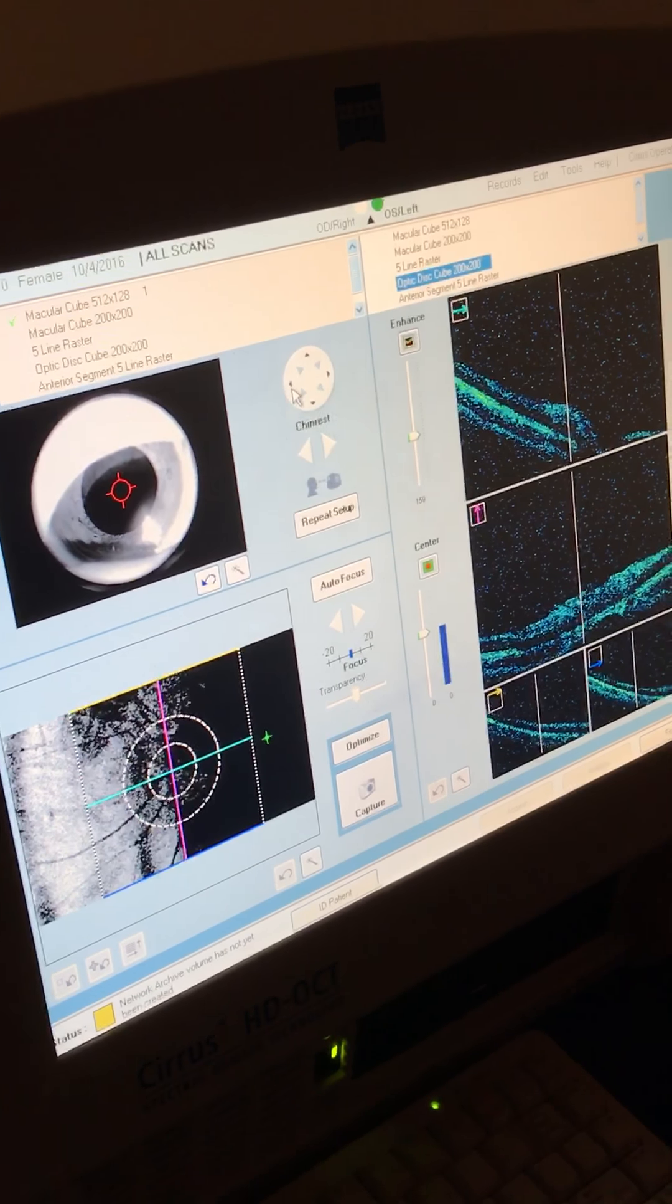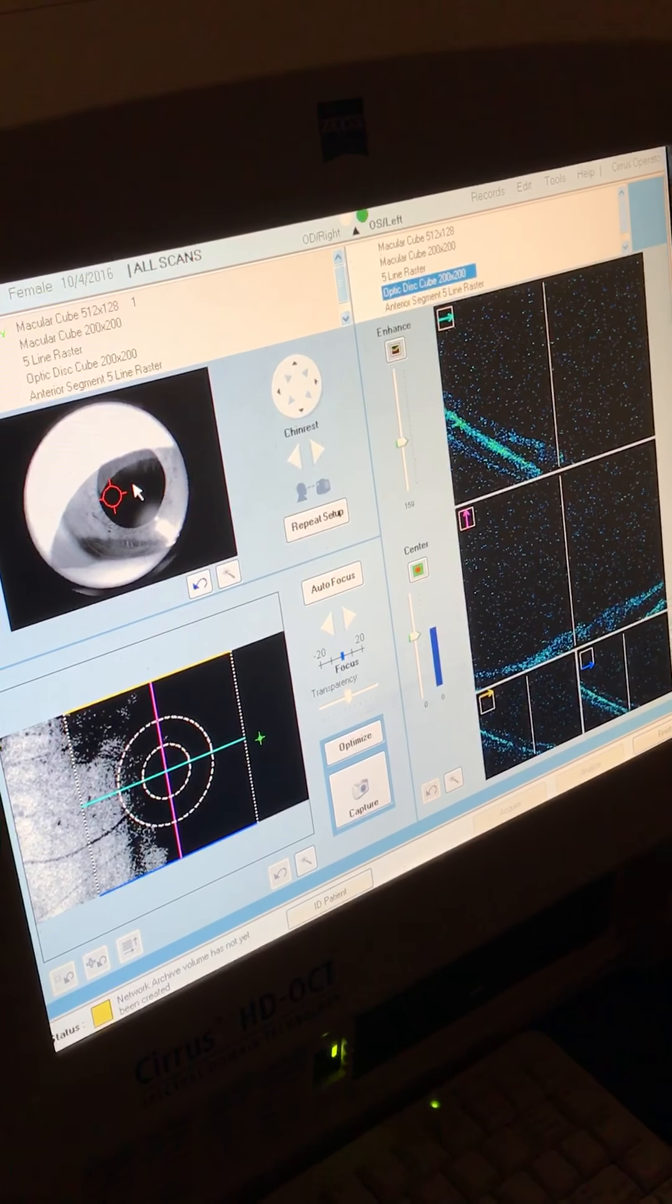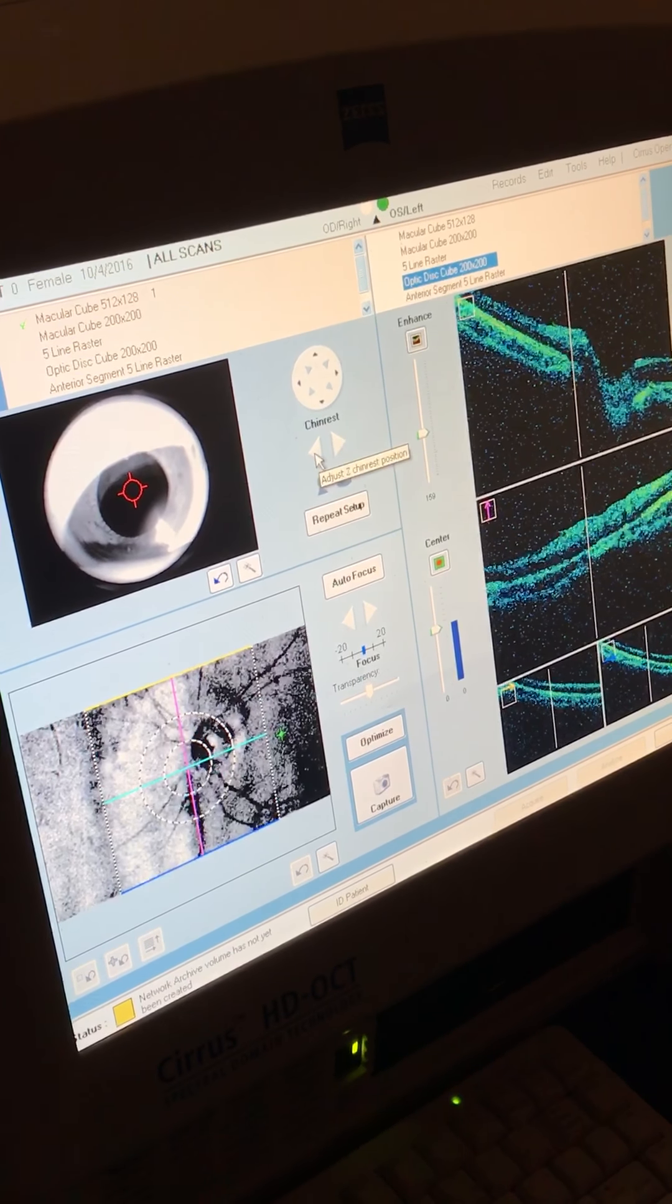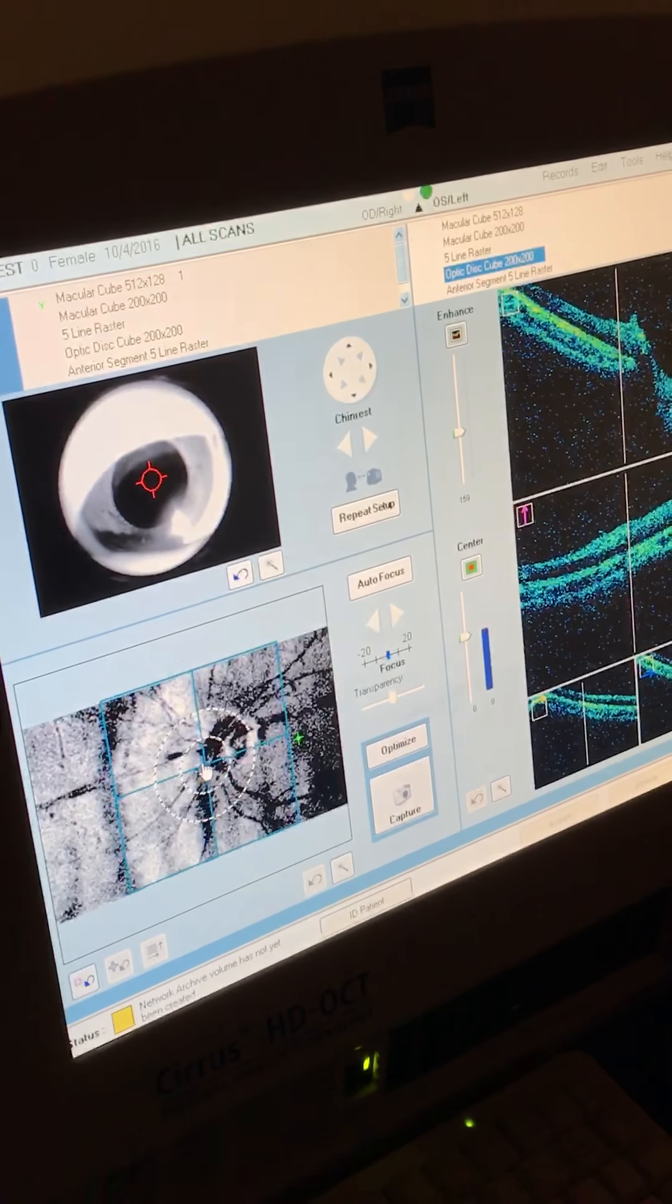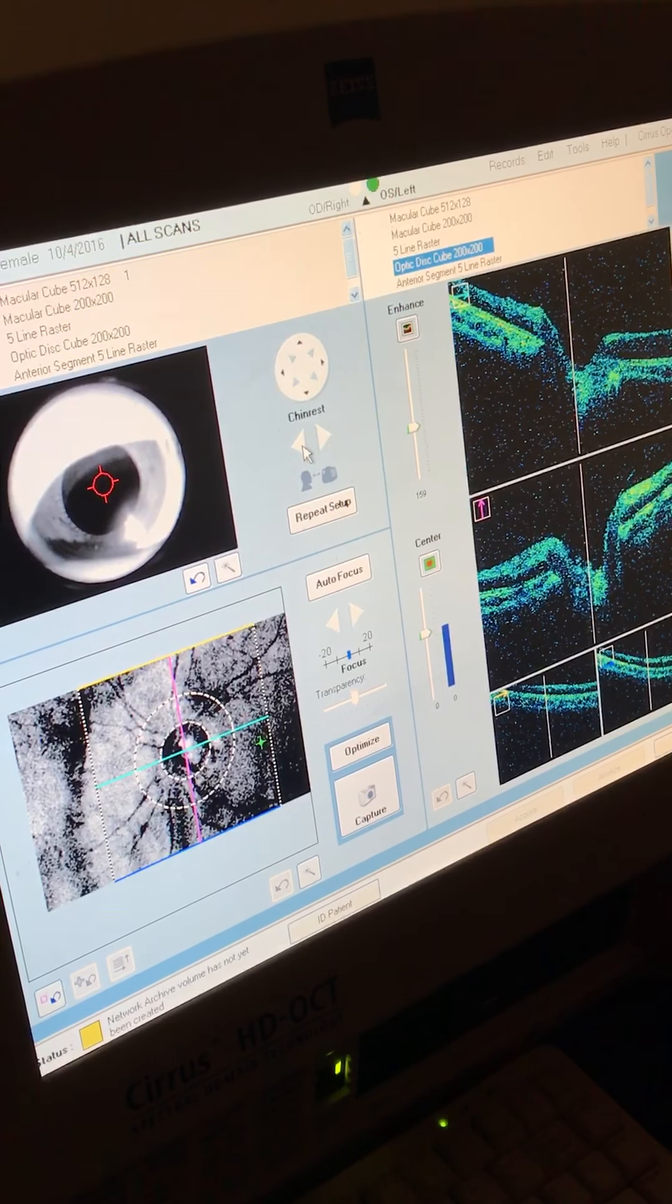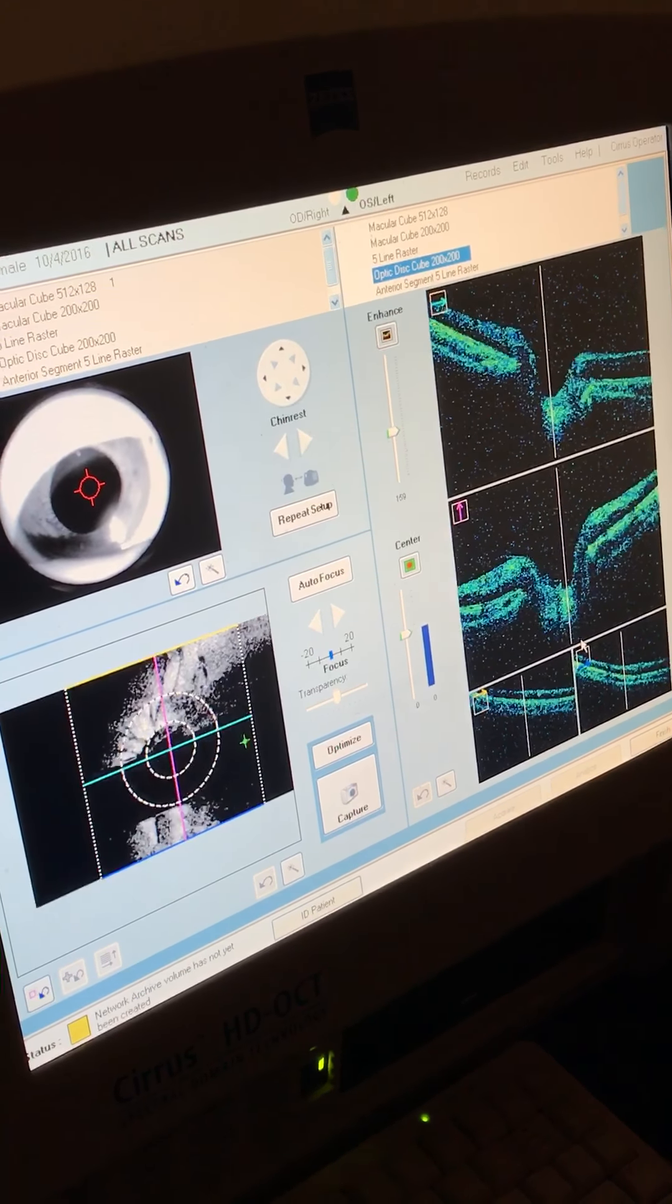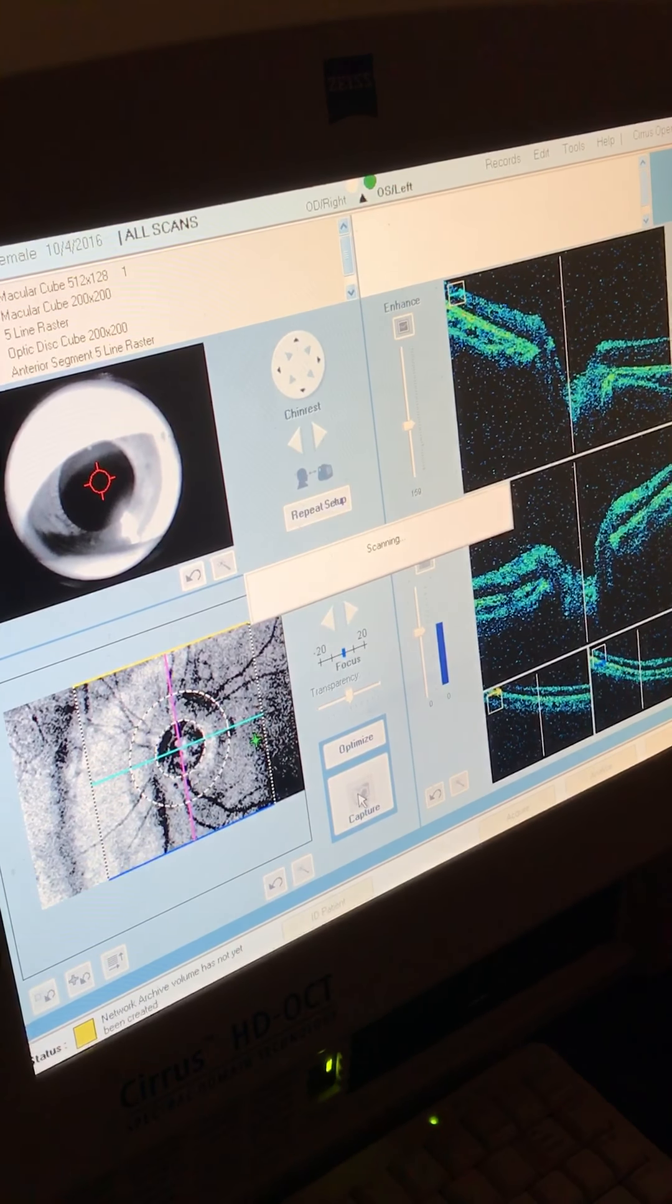So I want you to look at that star now. And then on the fundus here, you'll see her optic disc. So you want to move this circle over her nerve. And then once all these scans look clear, we're going to have her blink and then keep your eyes open now. And then we'll hit capture.